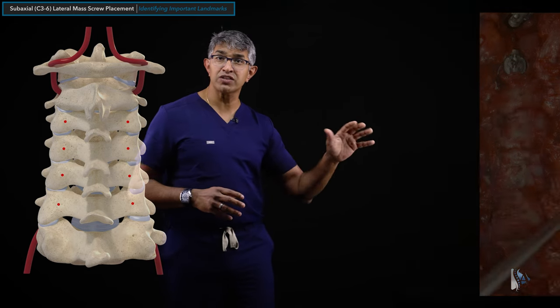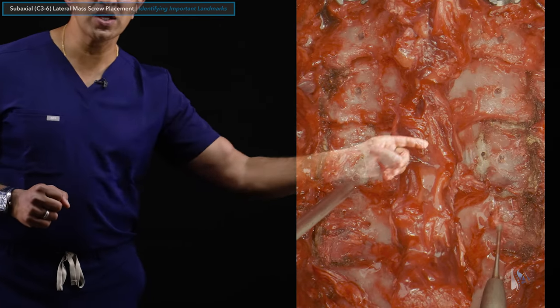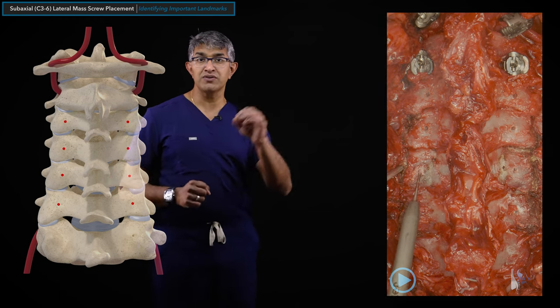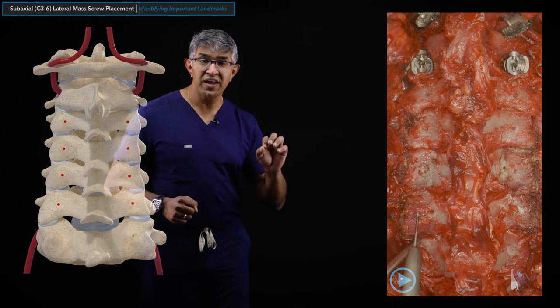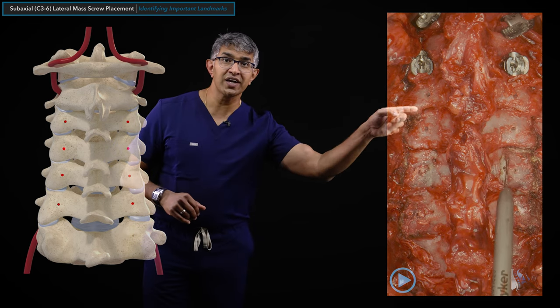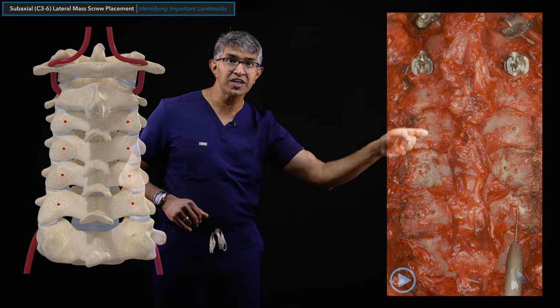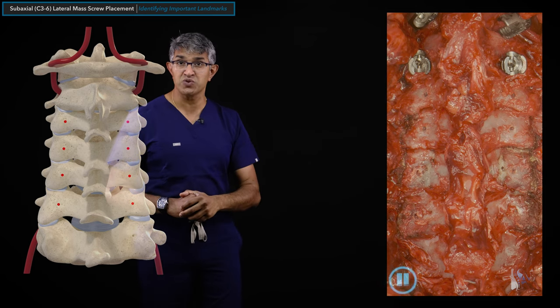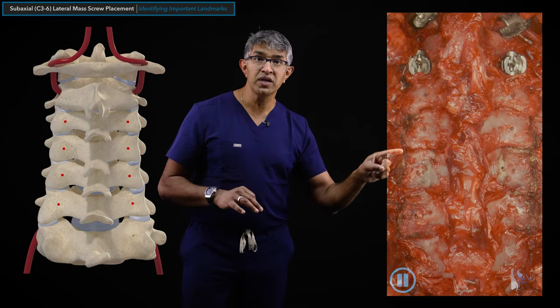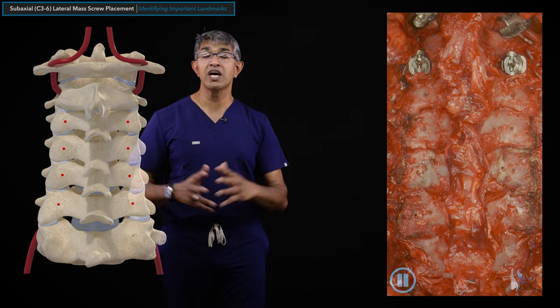Once those landmarks are established, I come in with a burr. I will identify the start points very clearly with a high-speed burr - either a 1.7mm bit or a 3mm matchstick bit. I look very carefully to confirm a satisfactory start point for each lateral mass and that they all line up. You can see here how the pilot holes line up pretty nicely - and you can even line them up into the thoracic spine as well. I make these start points deliberately, focusing on the boundaries of the lateral mass so each is at the midpoint.